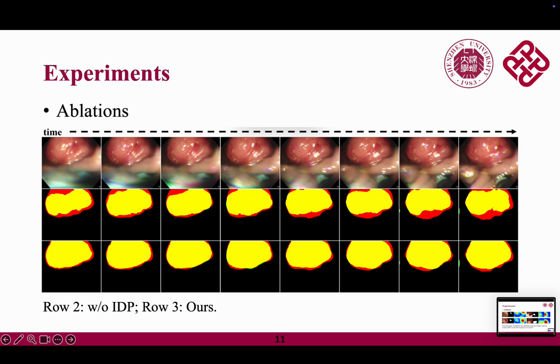However, there are still some limitations. As shown by the failure cases, the model may still struggle under extremely difficult conditions, such as missing details, distorted lighting or focus, and overlapping intestinal walls. These challenging cases provide directions for future work.